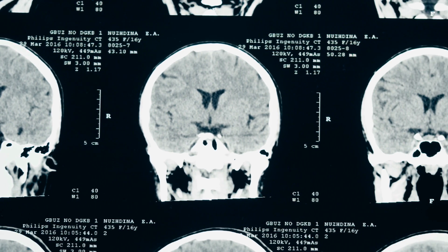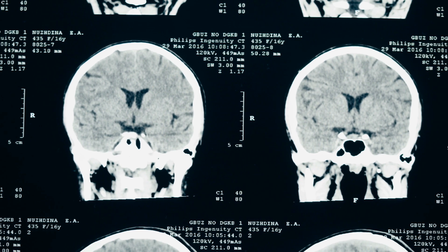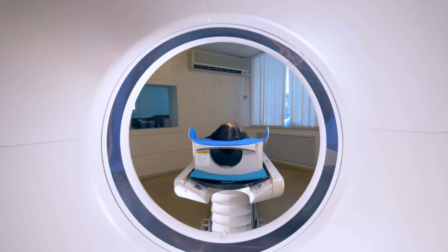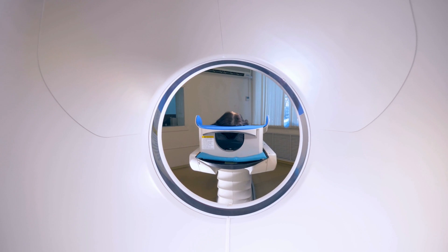For soft tissue structures you're really going to need to narrow that window width in order to visualize them. In combination with the window width is the window level, and we're going to get into how those two parameters affect our ability to visualize different structures within our CT images.